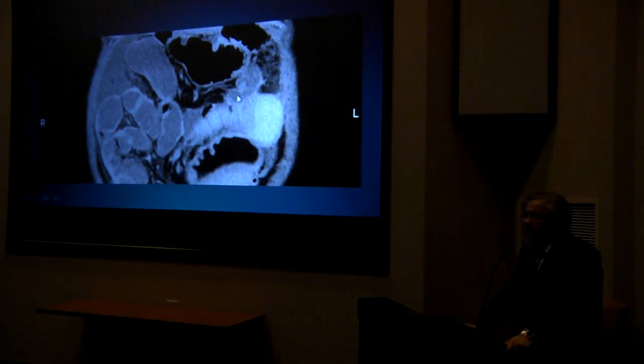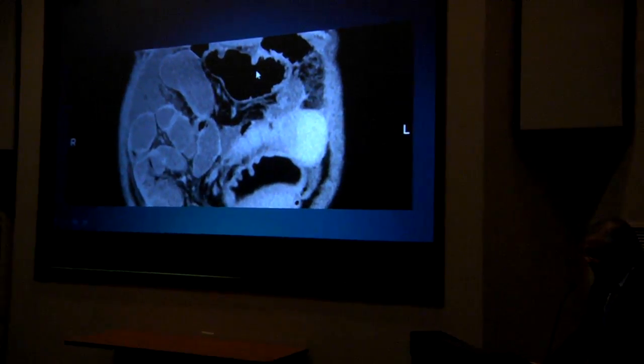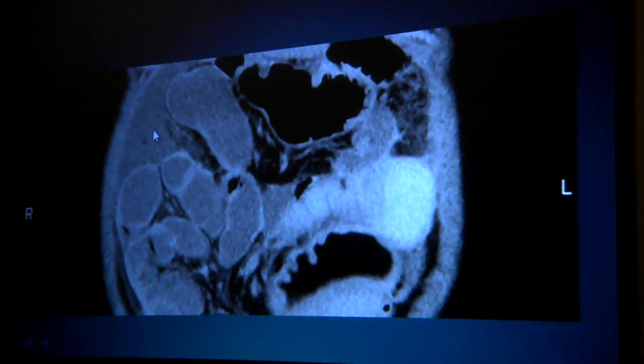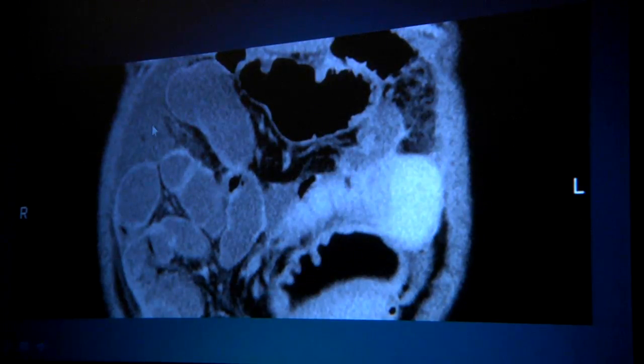This patient came in to our emergency room one evening, unfortunately about 11:30 at night, but we had had enough coffee and were awake and a few Cokes, and we're all tanked up with caffeine. Patient came in with abdominal distension and symptoms of a small bowel obstruction, and I think we can all see that there is evidence of intestinal obstruction. This is the greater curvature of the stomach. There's fluid up here in the right upper quadrant, and that fluid, to my eye, is a little dense, which would suggest that it's not just simple fluid. Perhaps it's an exudate, perhaps it's fluid that's bloody. It's not garden variety fluid.